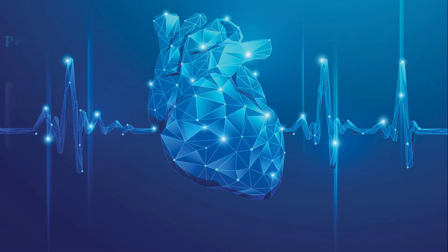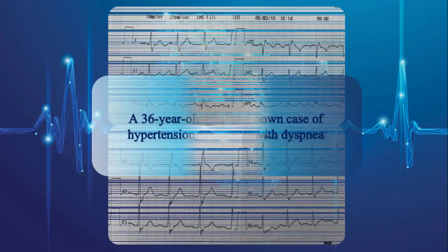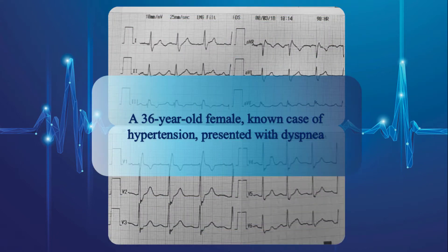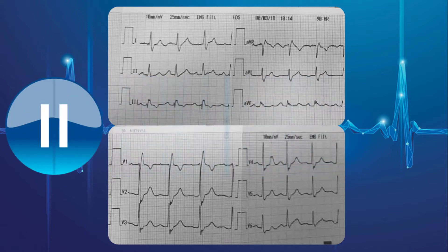Let's go through three real examples. The present strip belongs to a 36-year-old female, known case of hypertension, presented with dyspnea. What do you think about this strip? Does it require any immediate intervention? Before going through the EKG strip, pause the video and try it yourself, then play the video again and compare your findings with the correct answer.